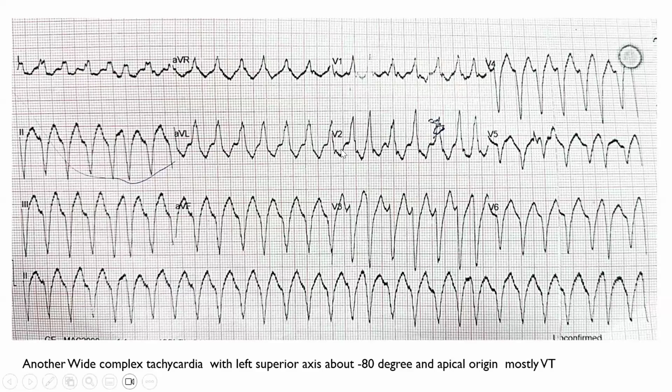So this patient also has an apical VT arising from the inferior wall. So at least we have 2 different exits of tachycardia, or 2 tachycardia isthmuses, both sharing apical origin, one from the lateral wall and one from the inferior wall.